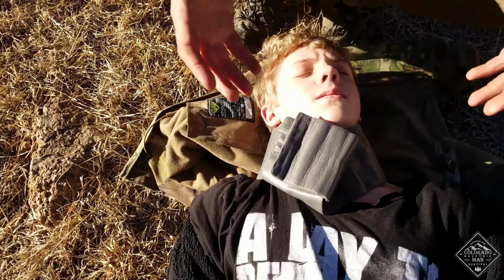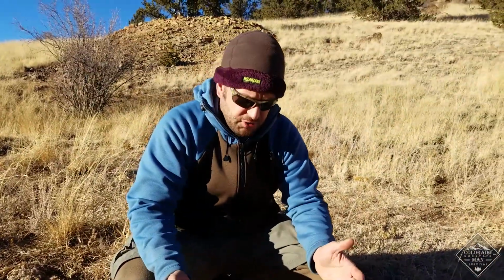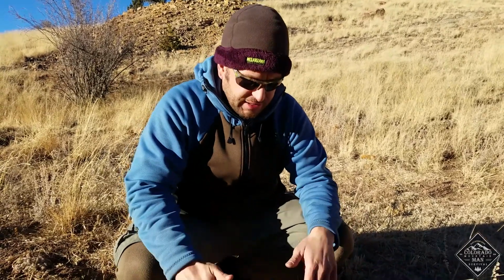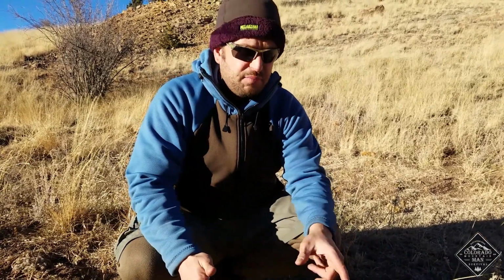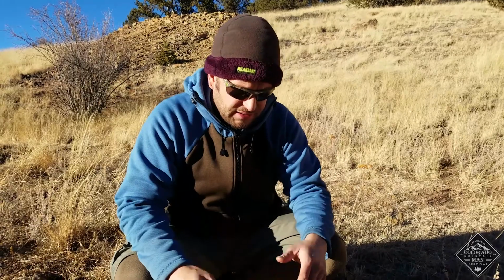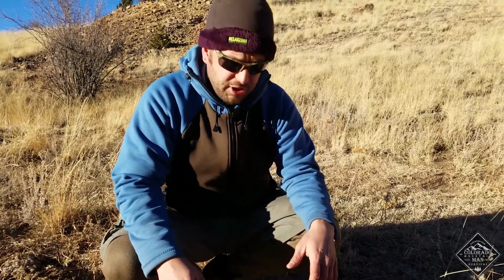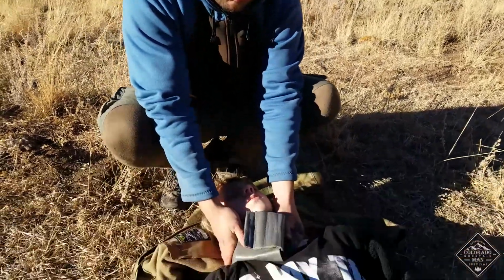So good enough for a primary assessment, right? So you come upon somebody, they just fell, you don't know what's going on, there's blood on the scene, whatever, nothing massive you can see. You got to take care of that C-collar, because if you start palpating somewhere and they sit up in pain and they have a fracture and they move and they become paralyzed, you know, that's going to be on you. So part of the scene size up, the last component is evaluate the mechanism of injury and see if a C-collar is appropriate. If so, you can just slap that on really, really quickly.